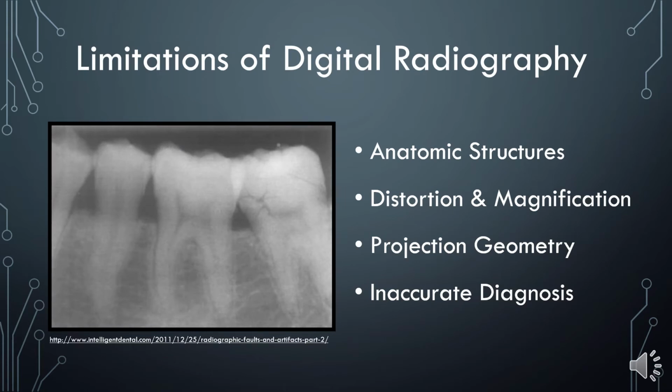Limitations include the superposition of anatomic structures and projection geometry of the X-ray beam. This may cause magnification, distortion, and inaccurate diagnosis. Obscurities are found on furcations and buccal and lingual bone defects. Therefore, the use of 3D images has increased.